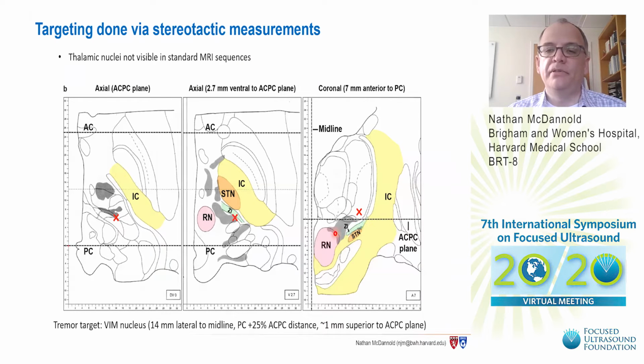It's also lined up in the lateral direction with the subthalamic nucleus. Looking a bit more ventrally in an axial image, we can see that the target is also approximately aligned with the red nucleus in the AP direction.